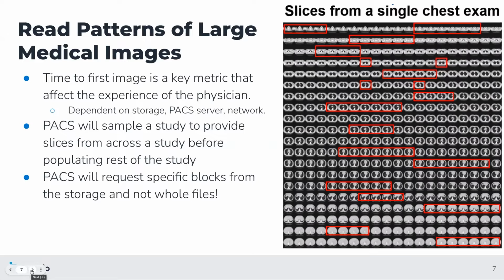So if these were on the hard drives, we move them up to the SSD or the all-flash layer, or even promote them to RAM in order to provide as fast an access to that data as possible. And this has obvious implications for hospitals and healthcare workers, in that we save them wall clock time. A radiologist double clicks, and they're not waiting tens of seconds in some cases for the entire study to show up. The study is there for them as soon as they click.